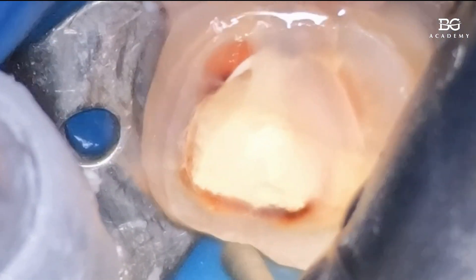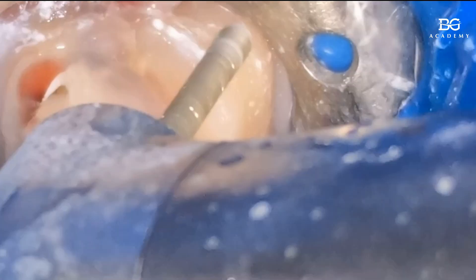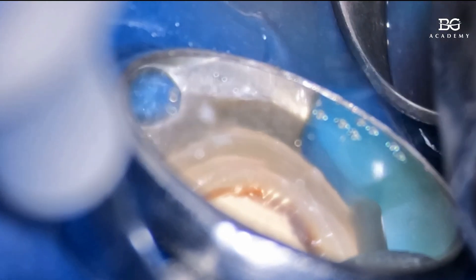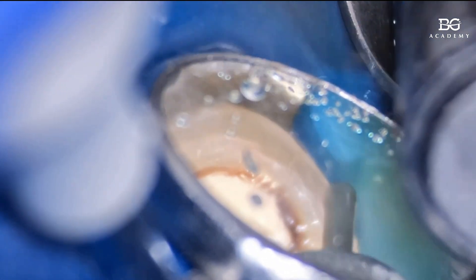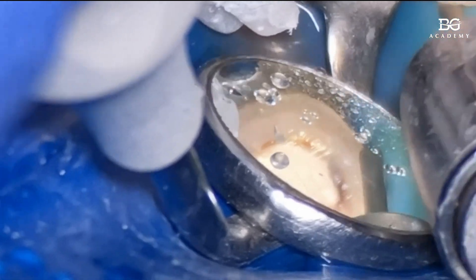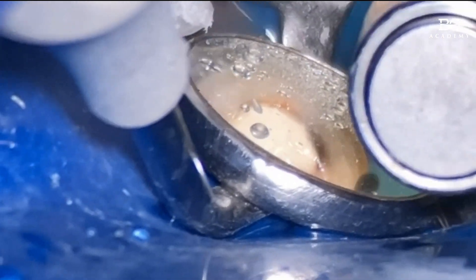I would like to show you a video. You can see the typical scenario here — this is the second molar, the last molar in a row, where I'm prepping the tooth with the Rubberdam on. You can see that the process is very clear. The Rubberdam gives a lot of retraction and also a nice light reflection, so basically when you have the Rubberdam on, the light reflects better and you can see everything related to the treatment much better. You can see the distal area clearly, and I can prep the distal margin using a very small mirror. That's also a small tip, because sometimes we cannot have room to place both the mirror and the handpiece at the same time, so you have to have very small mirrors in your instrument set.